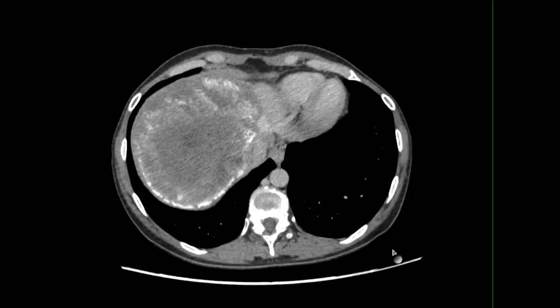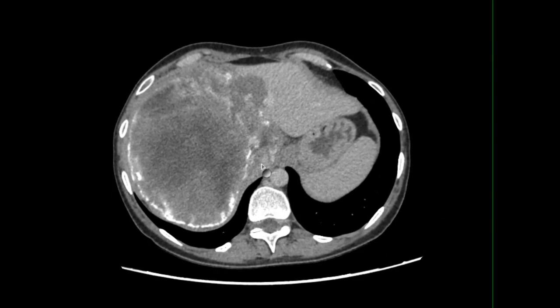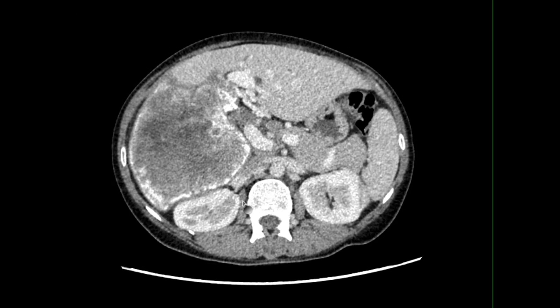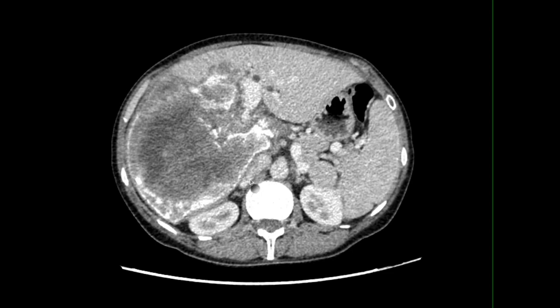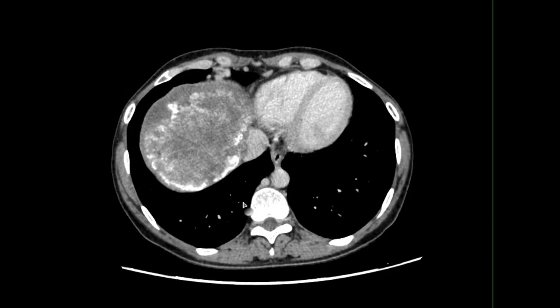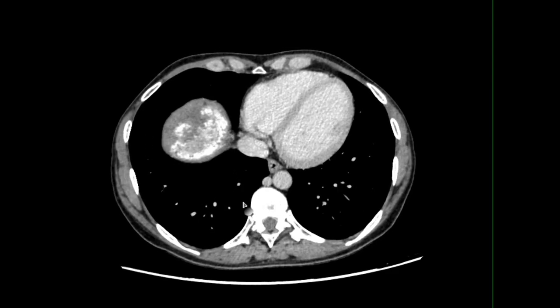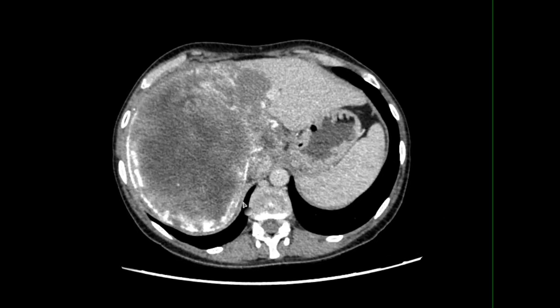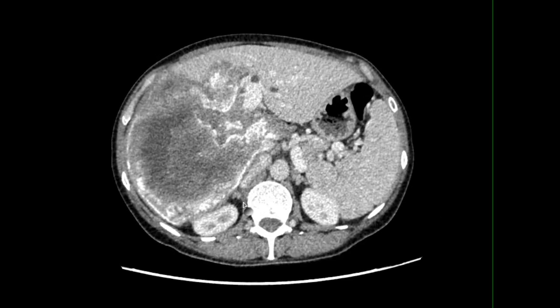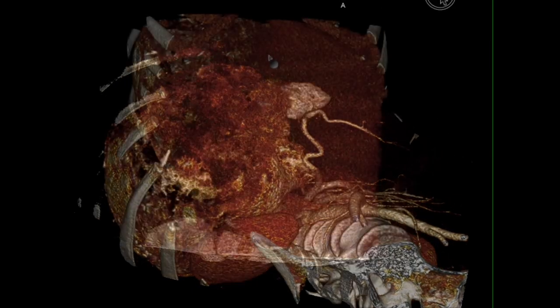Now let's take a look at this surgery. This patient is suffering from advanced hepatic alveolar echinococcosis. As you can see, the lesion involves the retrohepatic IVC and the entire right lobe of the liver. It also extends to the hepatic sinus and longitudinally involves the middle wall of the left hepatic vein. You can also notice the hypertrophy of the left lateral section in response to occlusion of the right portal vein.